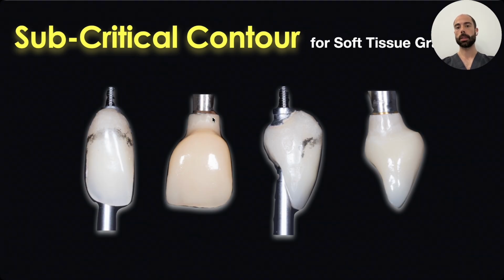The emergence profile of any implant restoration has two zones: the critical contour and the subcritical contour. Now, the critical contour is that area that supports the free gingival margin, and the subcritical contour is everything apical to that, in contact with the sulcular epithelium and connective tissue. When you're doing a CTG simultaneously with immediate loading, we deliberately undercontour the subcritical zone of the provisional. We give the graft room, we don't compress it, we let biology do the work.